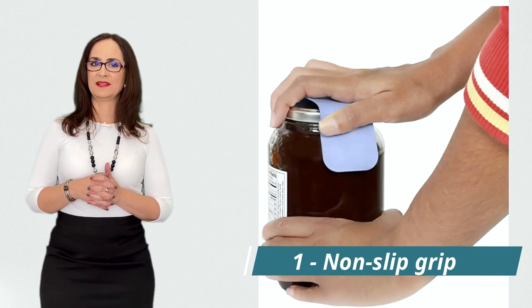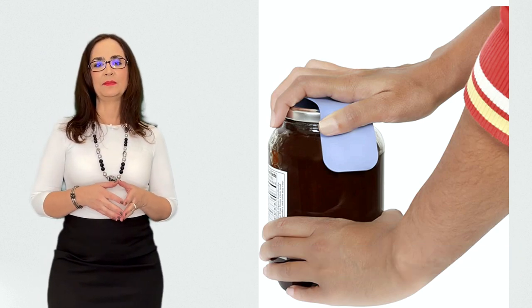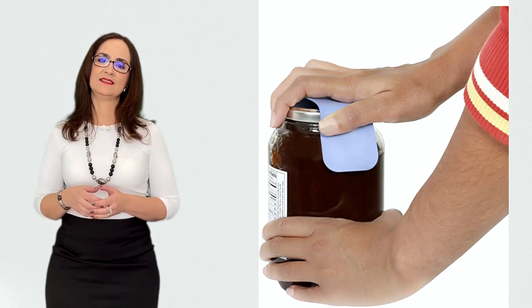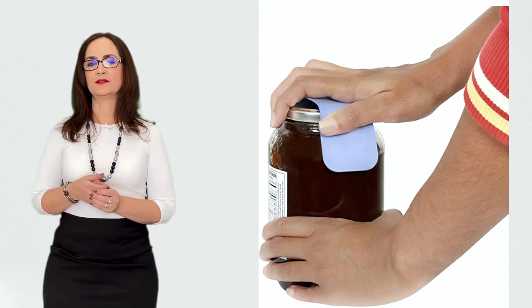Today I will show you 15 aids. This is a non-slip grip that I have at home to open jars that are too hard for me. They make gripping and twisting a lot easier and less painful. You can use this to open lids of jars and bottles.